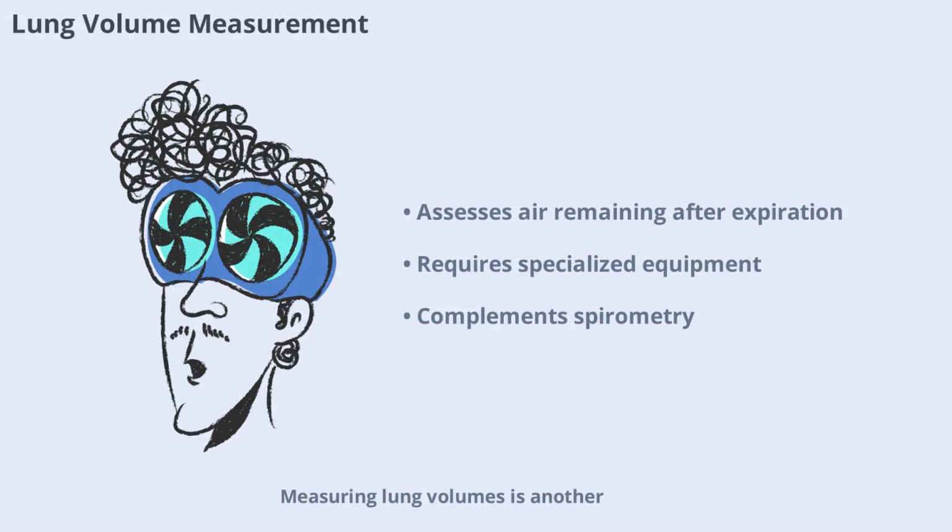Measuring lung volumes is another key aspect of pulmonary function testing. Unlike spirometry, which measures air that can be moved in and out, lung volume tests assess the amount of air remaining in the lungs after maximal expiration.